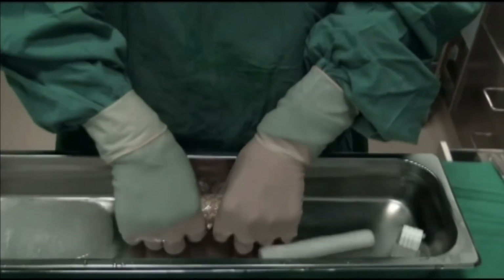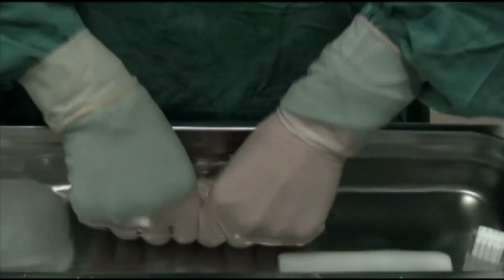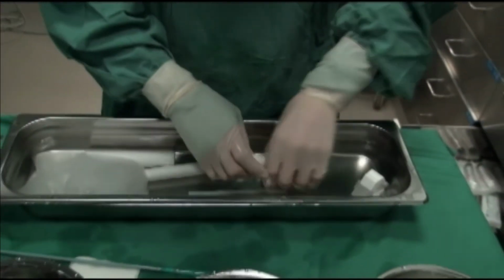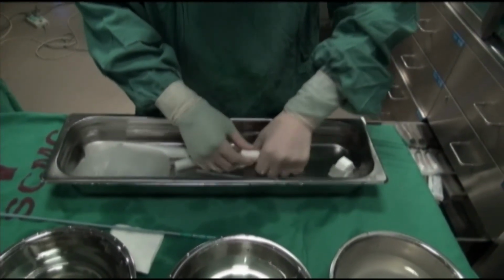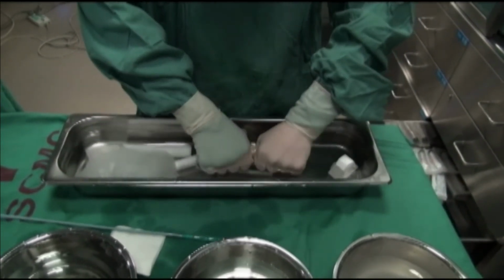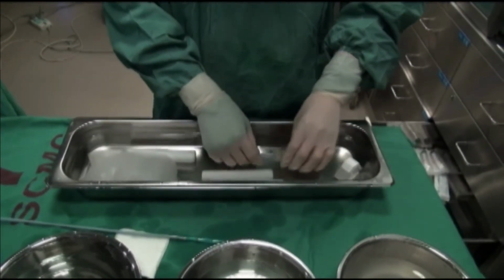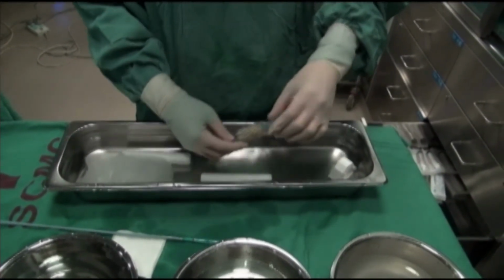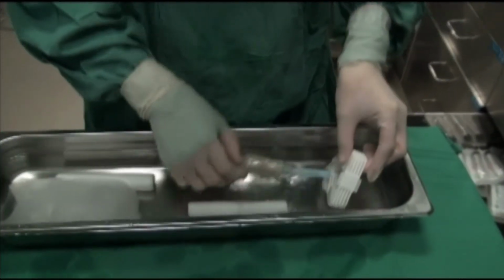Now we show, you can see the ice. In the ice water, they lose the memory, so we were crimping the valve to make it smaller, then we can put it in the delivery sheath. Tube to protect the valve. This is a small crimping, to compress this valve.